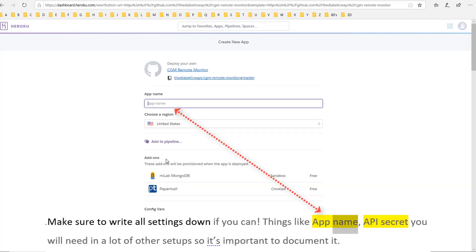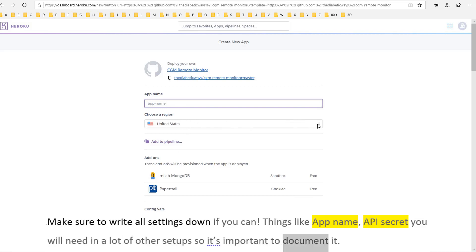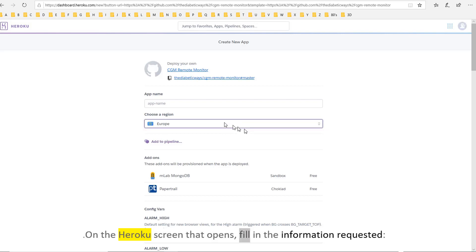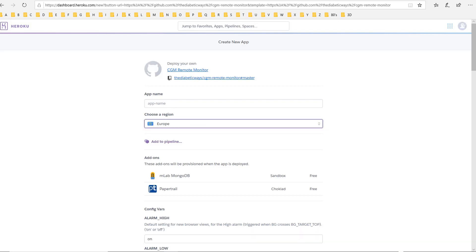Make sure to write all settings down if you can. Things like app name and API secret you will need in a lot of other setups, so it's important to document it. On the Heroku screen that opens, fill in the information requested.